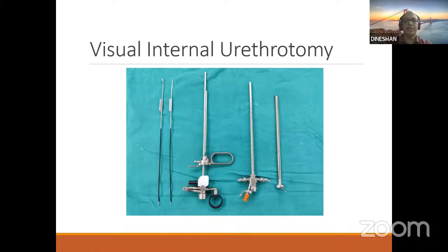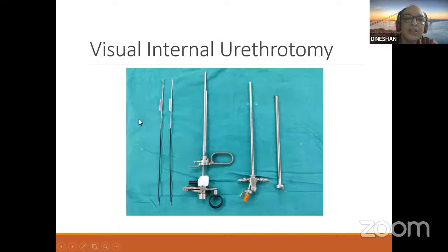You can see there are two different types of knife. One is the straight one, and this is the half moon, or semilunar, shape. The straight one is used for cutting the urethra, because here you use a 0-degree scope.